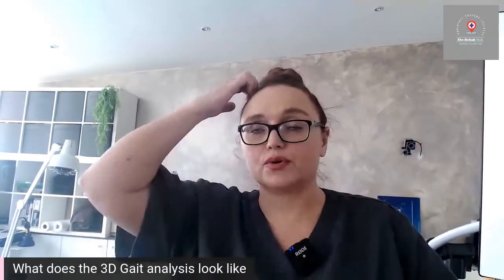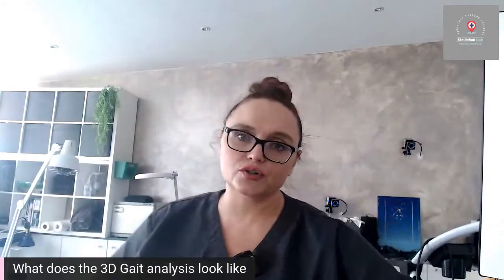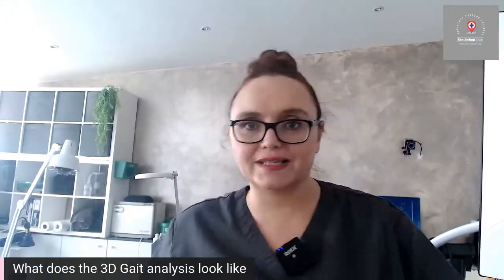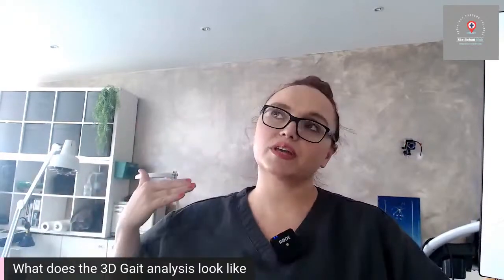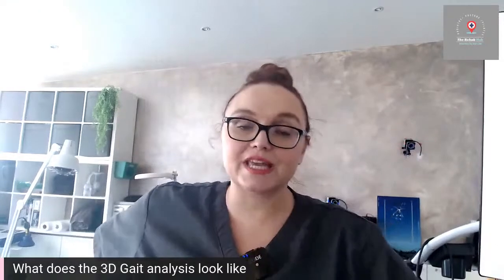Until we've analysed you, we won't know. So is it your stride length? Is it your cadence? Is it your speed? Is it what your feet are doing? Is it what your hips are doing? Is it strength somewhere? Are your hips not getting enough extension? Have you got too much extension? Is it your lower back? What is it? And then we can, in real time, get you linked up to the system and do gait retraining with you.